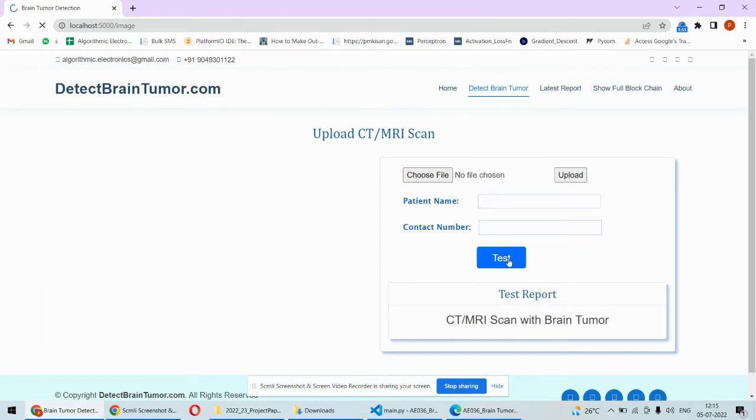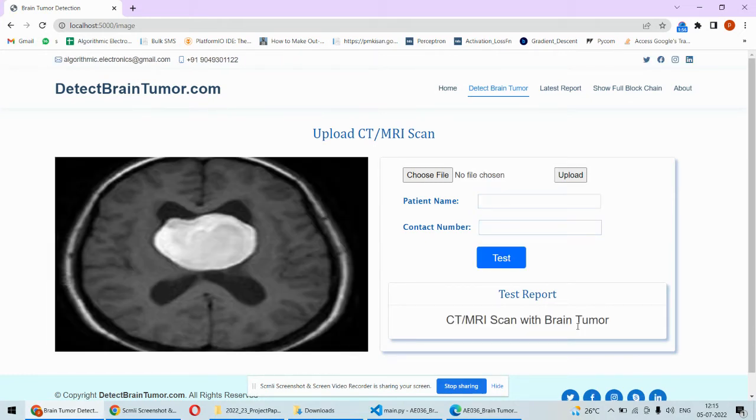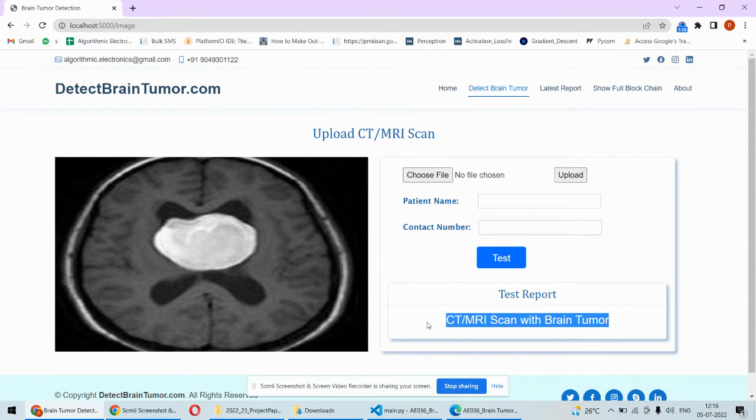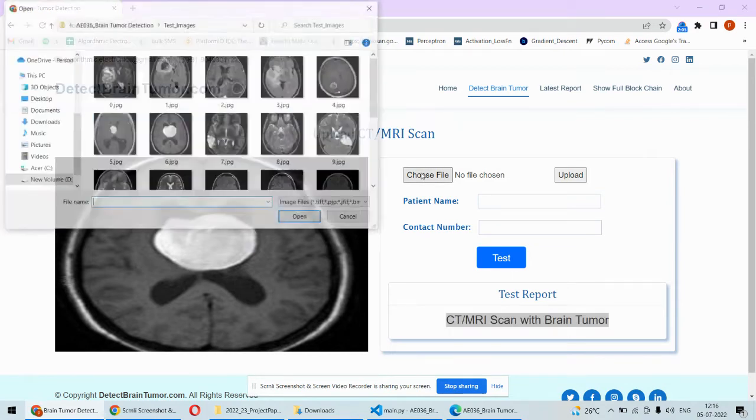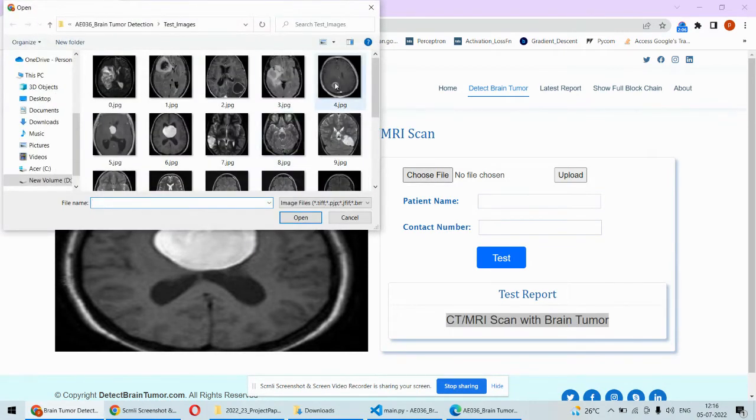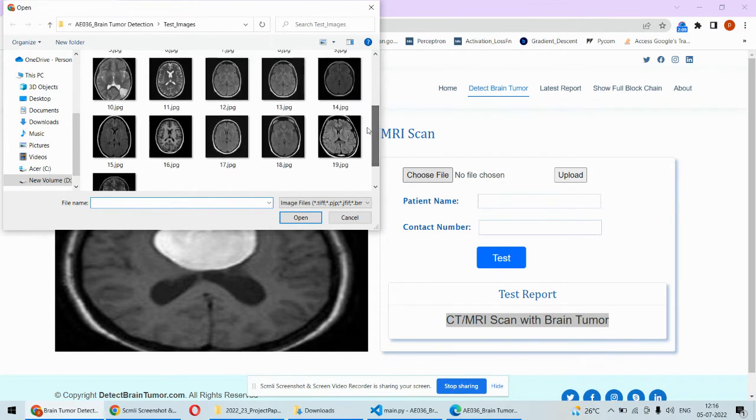Then you click on the test so here we'll get the CT or MRI scan with the brain tumor. So brain tumor is detected in this particular image. You may pick up something different or any other image as well.